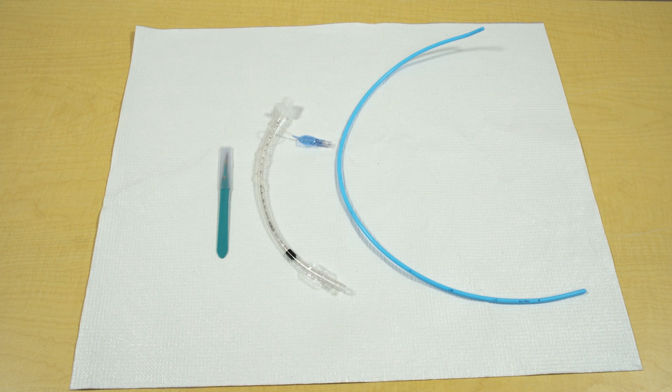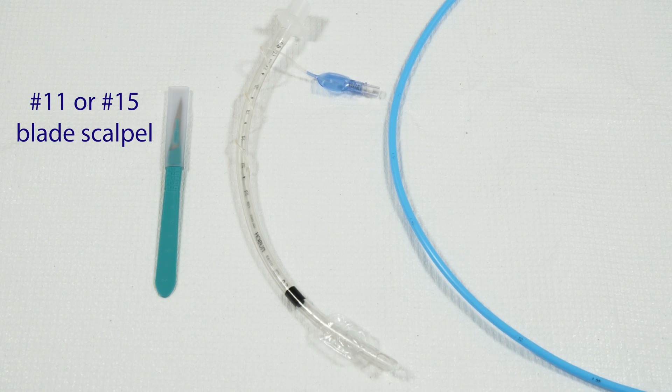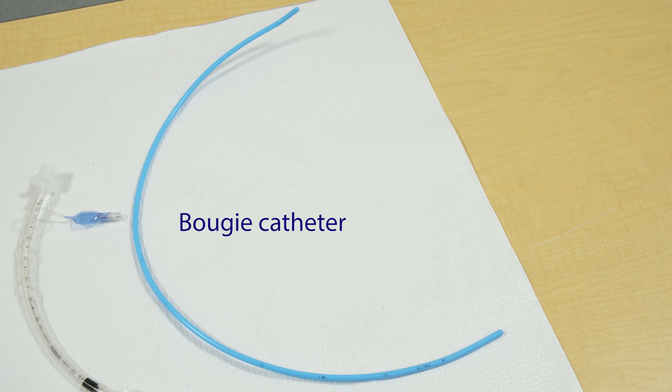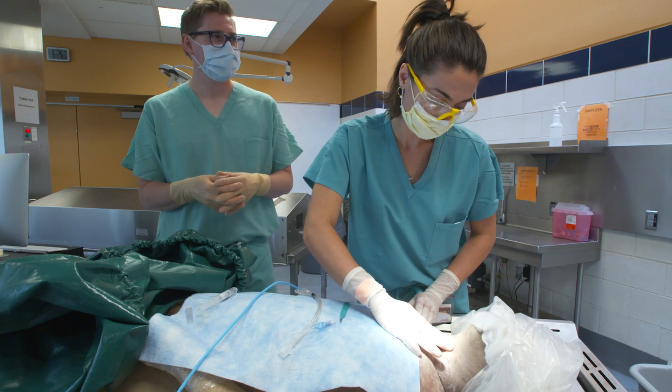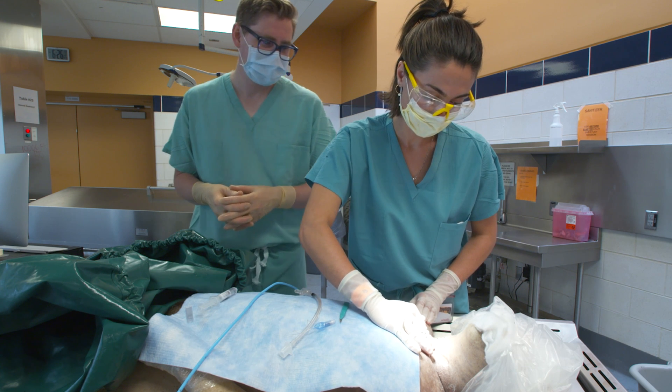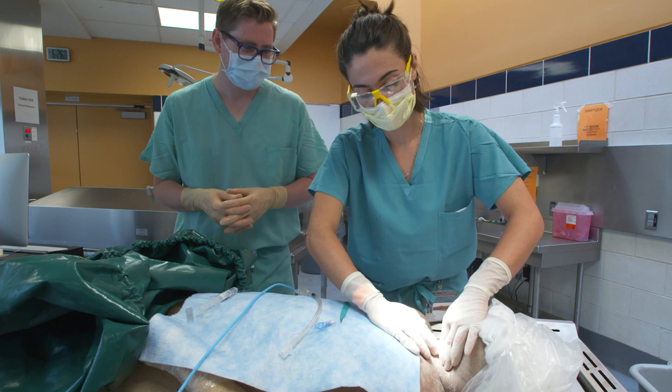We'll first demonstrate the scalpel, bougie, and 6-0 endotracheal tube method. All you need is a number 11 or number 15 blade scalpel, which are usually stocked in emergency airway carts, a flexible intubating or airway exchange catheter such as a bougie catheter, and a 6-0 or smaller endotracheal tube. A 6-0 tube is perfect for almost all adults and is typically available in most hospital settings and on code carts. A 5-0 ET tube will work as well but is less often stocked outside of the anesthesia setting. Set up your equipment within easy reach beforehand, and if you have time, maintain a sterile field by properly prepping and draping the anterior neck. However, when time is critical, do not worry about sterility.